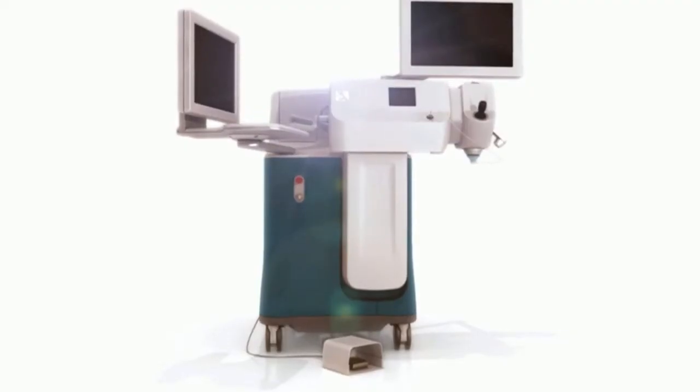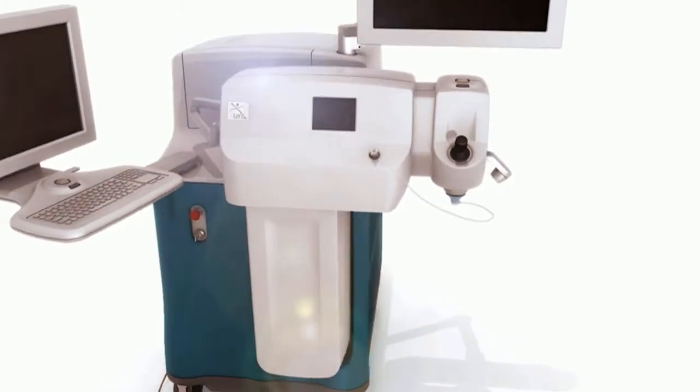We have this laser right here. It's a LensX laser, using a very short pulse laser to do cataract surgery. This is the first time in California that we're actually using this laser to perform the entire cataract surgery procedure.